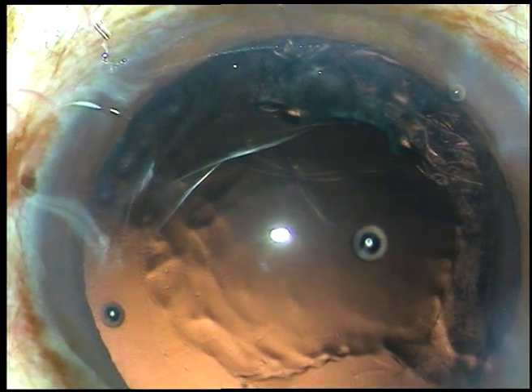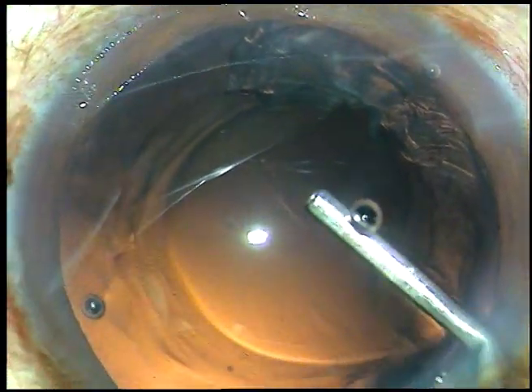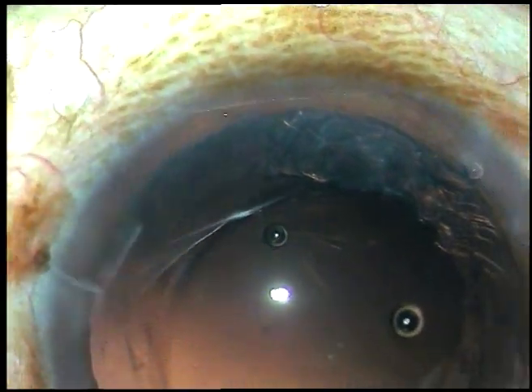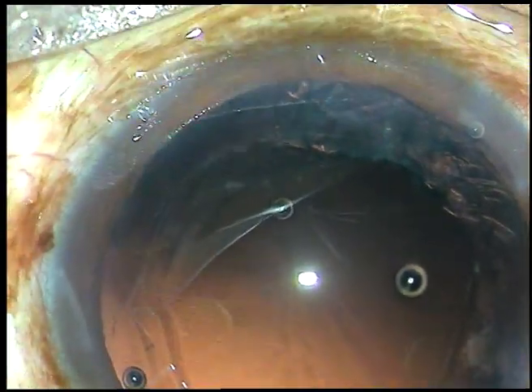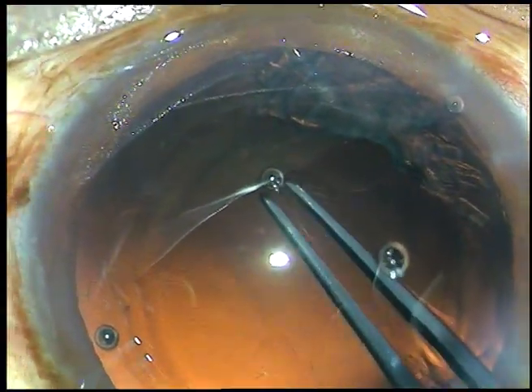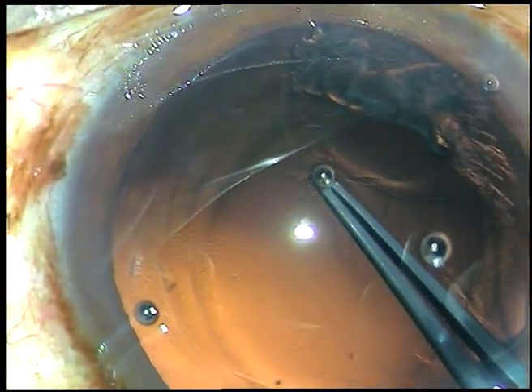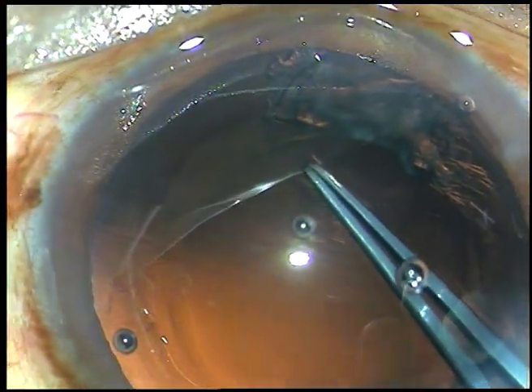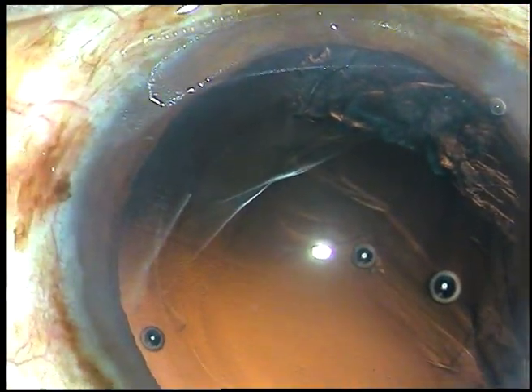When I inject viscoat I can see the rent very nicely, and now I will be able to convert this rent into a posterior capsular rhexis. I take the utrata forceps, hold it at the rent edge, and here I convert this into a posterior rhexis. A beautiful thing done — because this rent will not extend now.